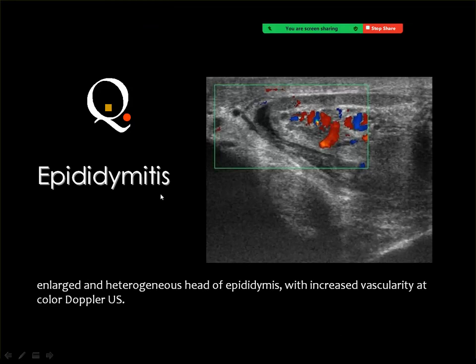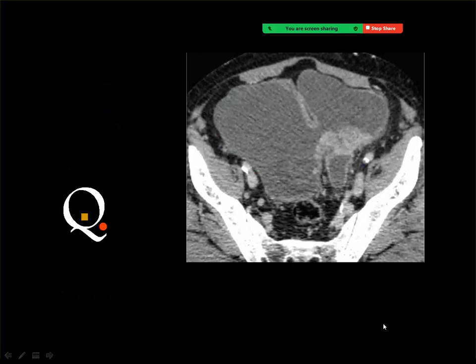of epididymitis, which can occur as an isolated lesion or can be associated with inflammation of the testicle, and at that time you can also see Doppler flow in the involved testis, and the diagnosis will be epididymo-orchitis.